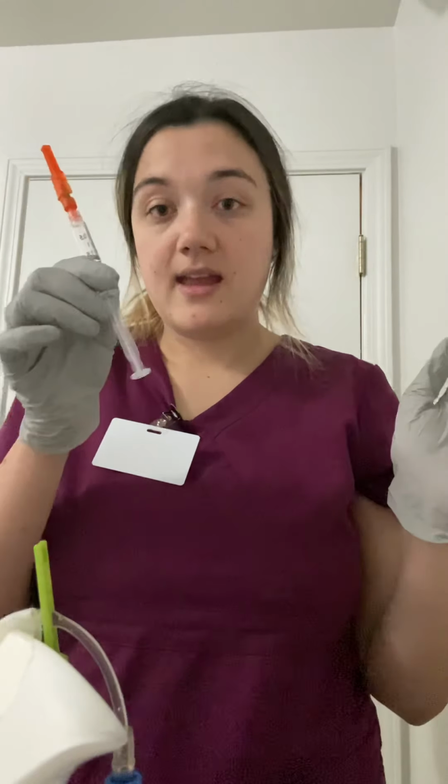So now I'm going to put this in the sharps, but I'm going to reuse this for this video, and I'm going to clamp this IV back in between uses. So now that is clamped down here. So now what I'm going to do next is push the medication, the 4 mils, and I would need another sterile pad for that.